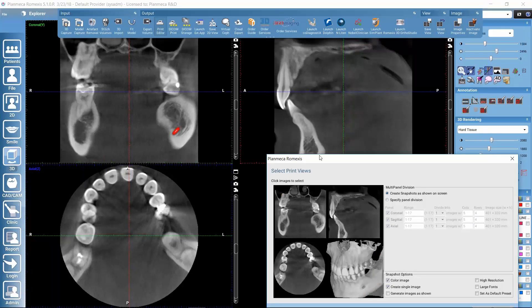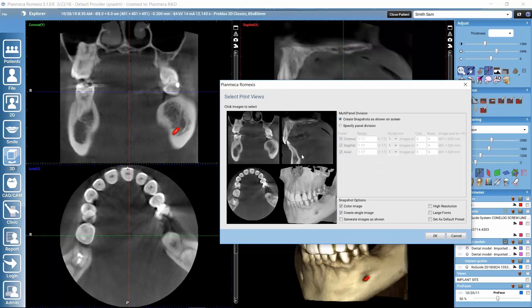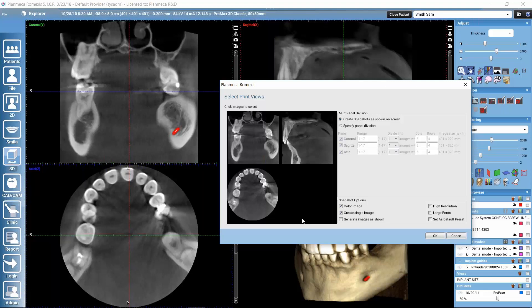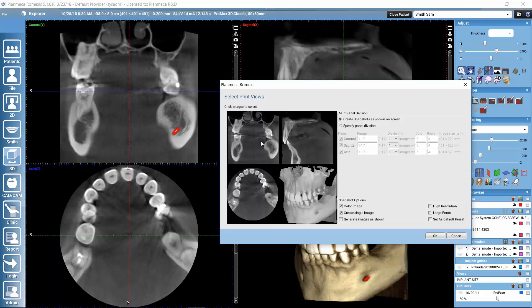Here we can determine which views we want to include in the printout. If we want to exclude some views at this stage, we can simply click on them. So now we wouldn't have our 3D rendered view or sagittal view. If we want to include them we can click back, and all 4 views would be brought to Print Editor. With the multi-panel division — you can find more information in the user's manual — we can still adjust the layout for different views in the printout.